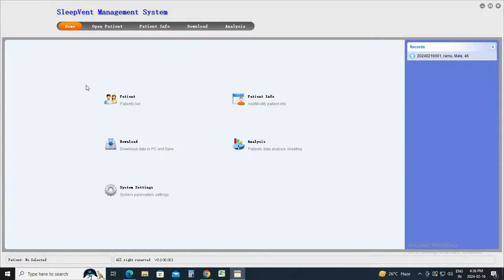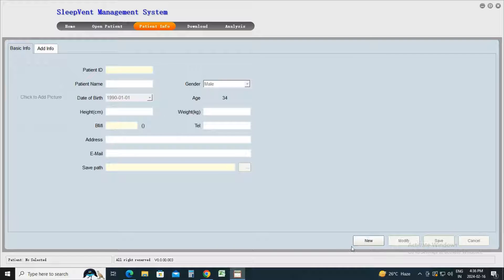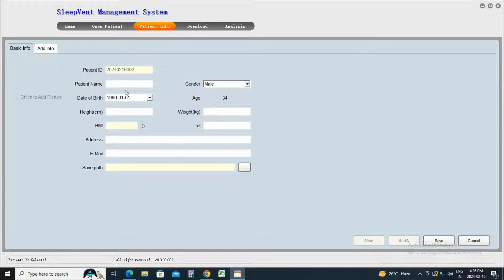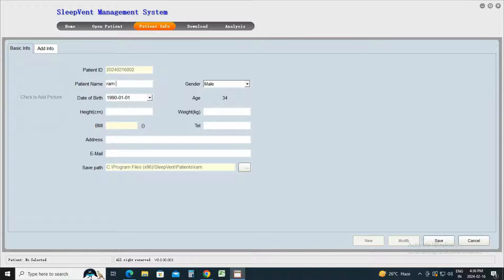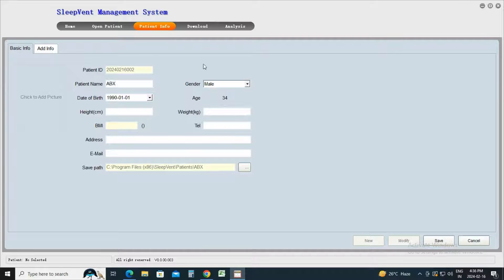Then, navigate to the Patient Info tab. To add patient information, click on the new tab and fill in the required details: patient name, date of birth, gender, age, weight, height, and address. Save the information by clicking on the Save button located at the bottom of the window.